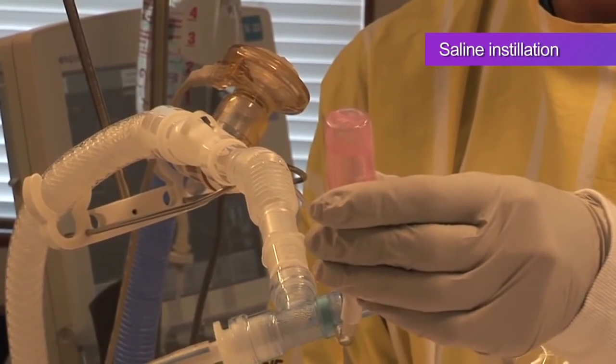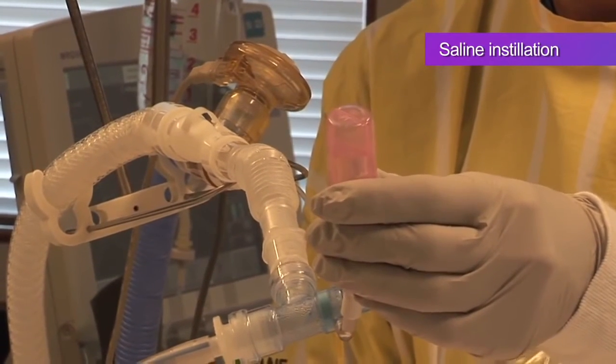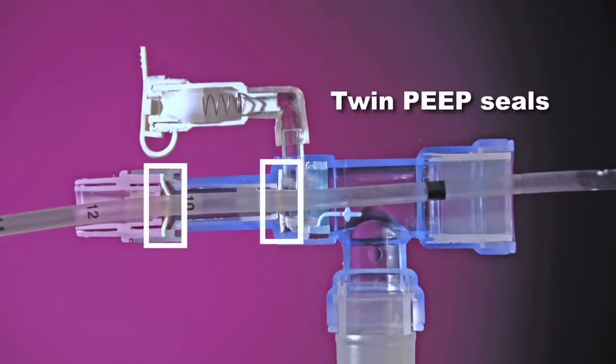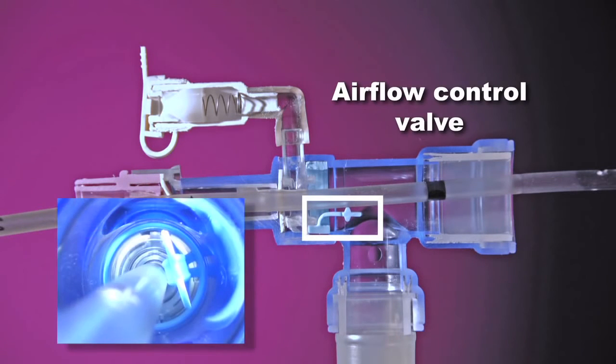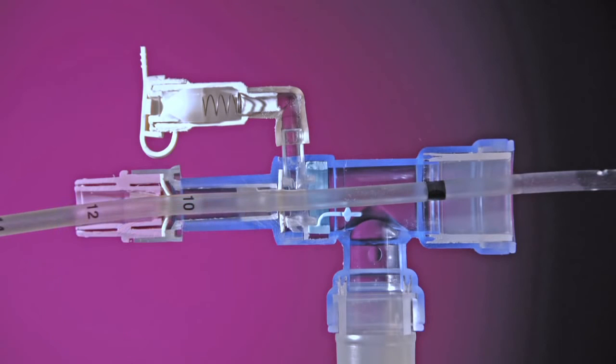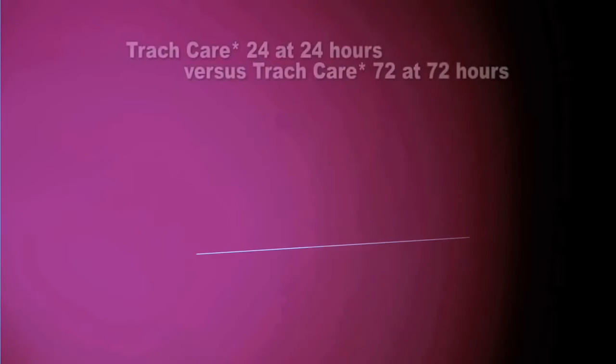Continue flushing until the catheter is clean. This is confirmed when you see clear fluid running in the catheter. The TrackCare 72 features unique twin PEEP seals, shown here, and an airflow control valve that closes off the cleaning chamber. These help to promote a more turbulent and effective cleaning of the catheter and tip.